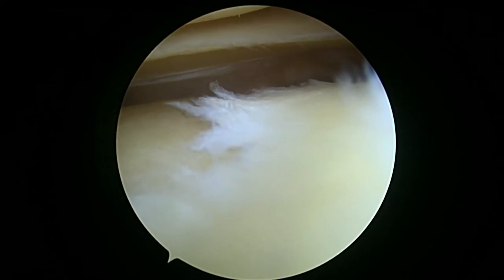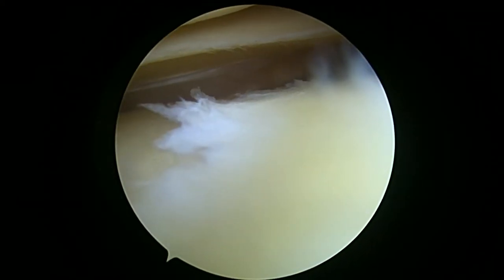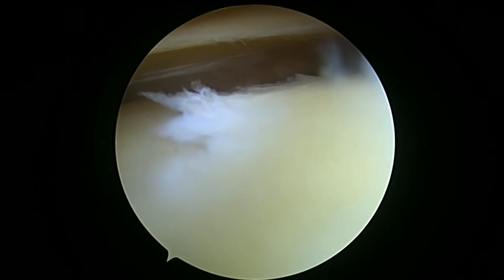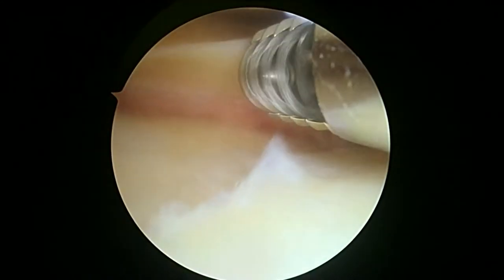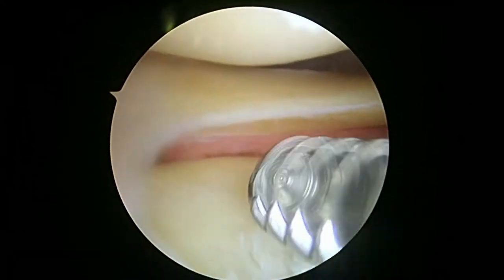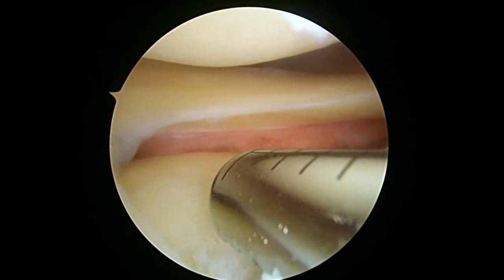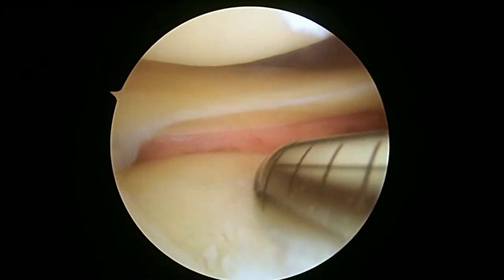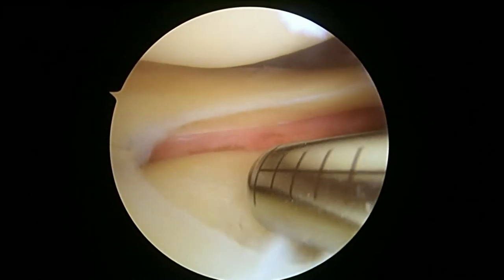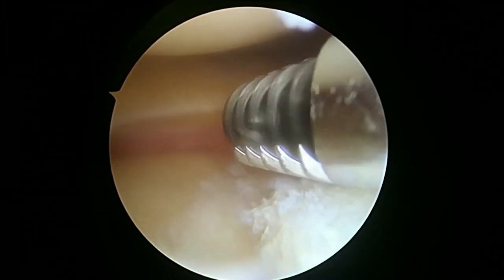We're going to go ahead, come on the other side so we can bend that knee up. We're going to go ahead and reposition the knee so we can maybe smooth some of that out for you in just a minute. Okay, here you can see how loose this cartilage is. See how it just kind of floats right up to the shaver with suction. That tells us it's not healthy and not normal. And that's something that can certainly cause symptoms and maybe even cause some clicking or catching in the knee.